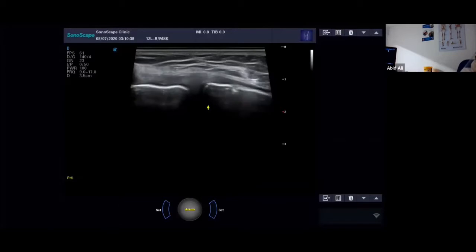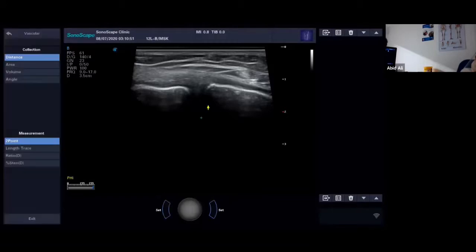There may be some figures in the literature for what it should be, but I've measured it in people with mild to moderate degenerative changes, and I think with the more advanced changes, they're down to about 2 to 3 millimeters, and sometimes you can even see bone on bone and very little cartilage in the middle.